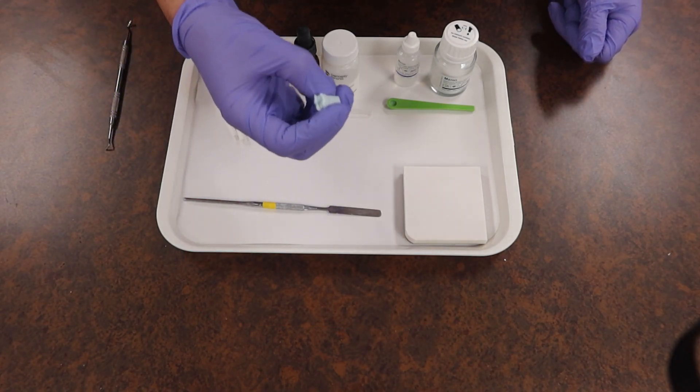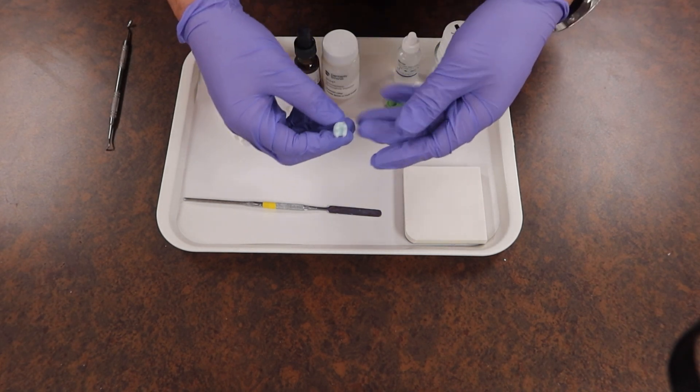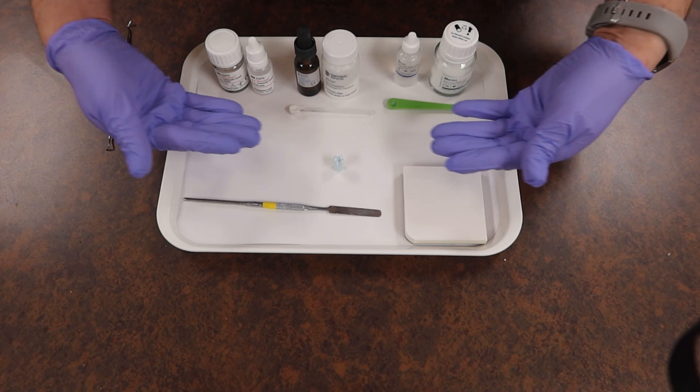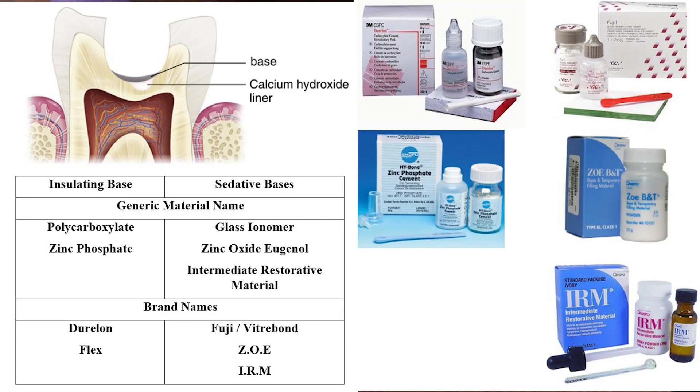For today's lesson, we are going to go over bases and how to place them into the small crevices that the doctor makes for us. We have a couple choices depending on what selection your doctor might want: polycarboxylate, IRM (also known as intermediate restorative material), or glass ionomer.